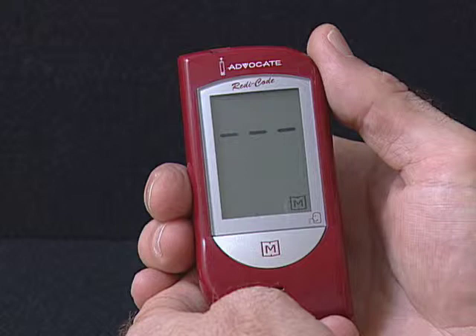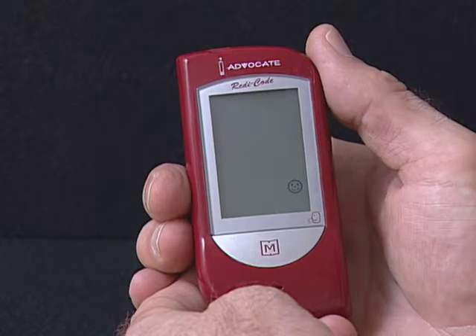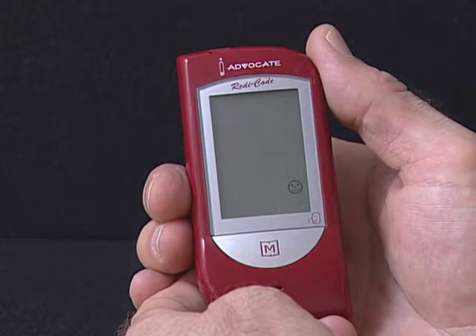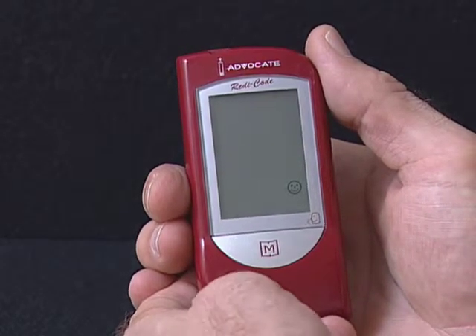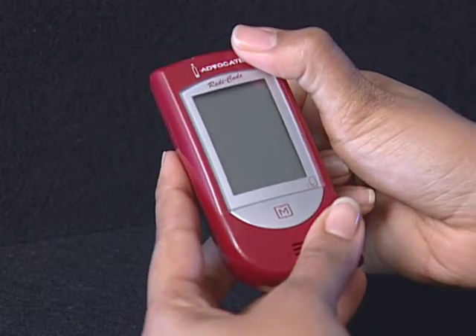If your meter has a talking symbol on it, please press the Set button to proceed to the next step. If not, you have completed the setting mode. Press the Set button to turn off the meter. Off is displayed before shutdown.